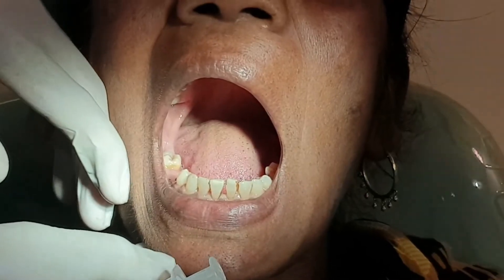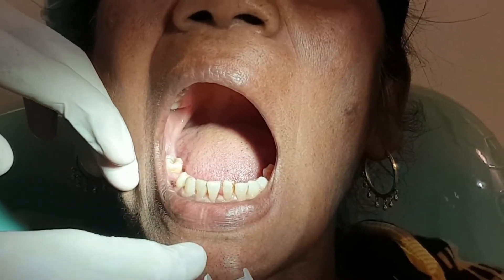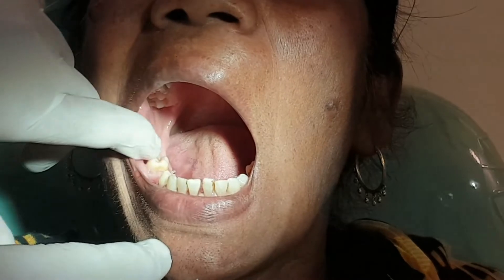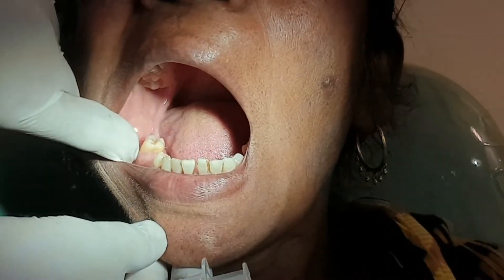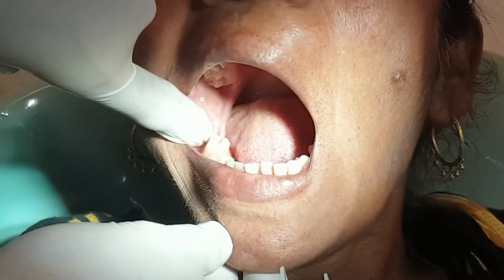The patient is made to sit at the dental chair so that the mandible is parallel to the floor. Then we palpate the landmarks — the external oblique ridge and the retromolar triangle.